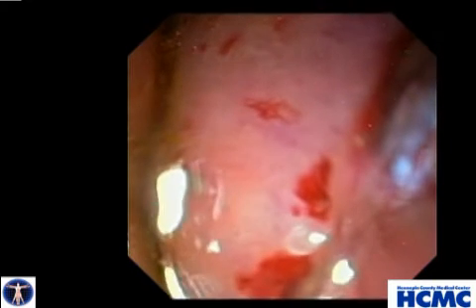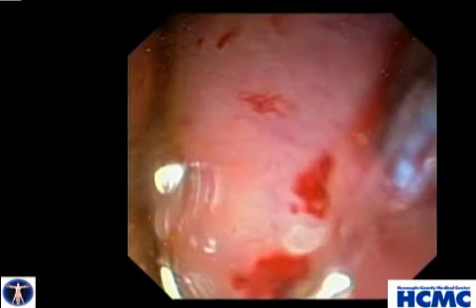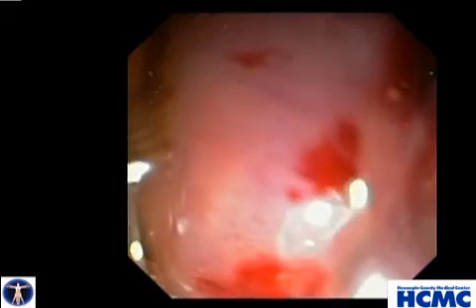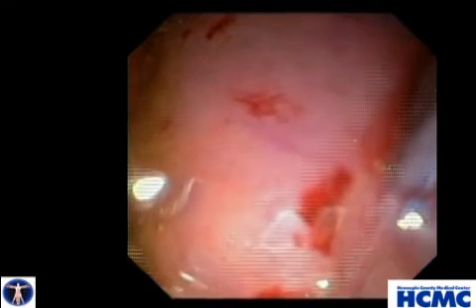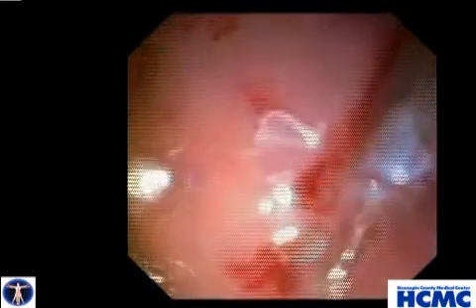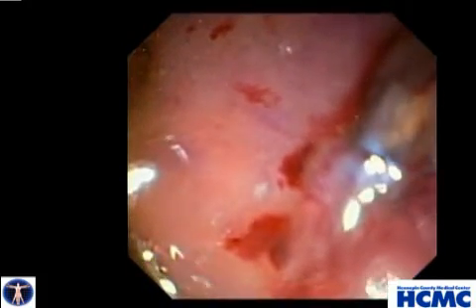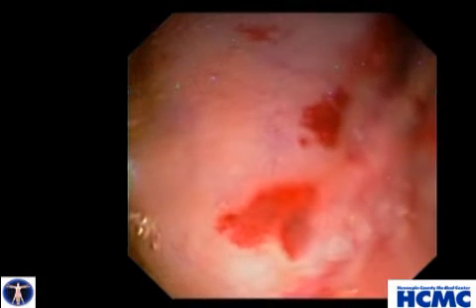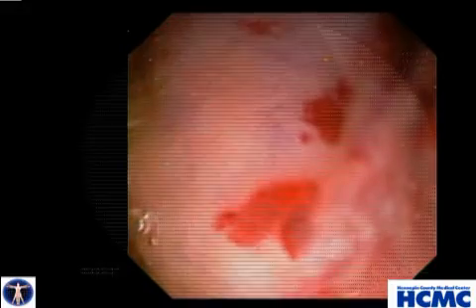A triple lumen micro-knife needle knife is preloaded with an 035 guide wire in contrast. Here you see in slow motion the retracted needle knife probing into the bulging antrum towards the cyst. When satisfied with the direction, the needle knife is extended and a brief tap on the cautery pops the needle knife through the wall into the cyst. There's puncture without any cutting motion.